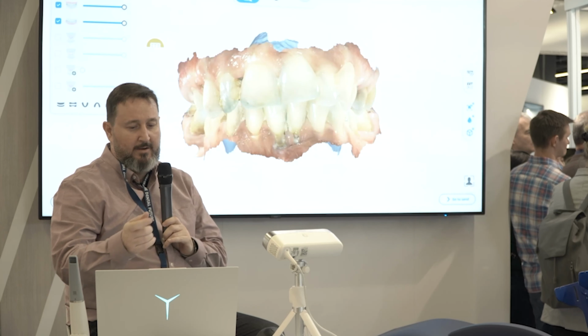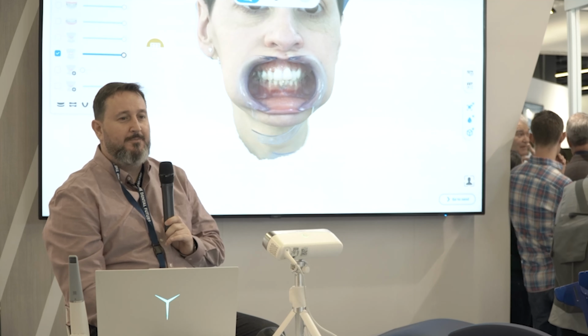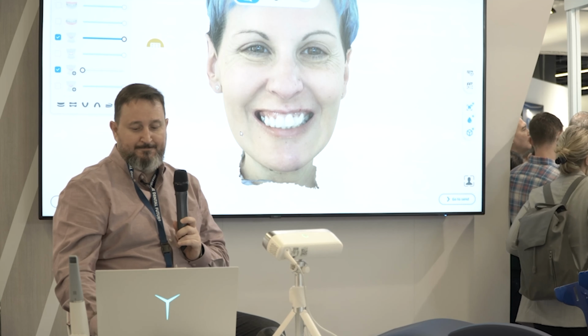Okay, I don't want to bother anymore. Look, now we have the jaws, and we are able to load this girl. Yes, it's exactly the one, but she doesn't speak. It is better. So here we take an open bite, and with this open bite we will make an alignment, and this match will help us. But we can take different shots with different movements. If it's smiling, mid-smile, okay? Because everything changes when you are speaking. Everything changes when you are working.